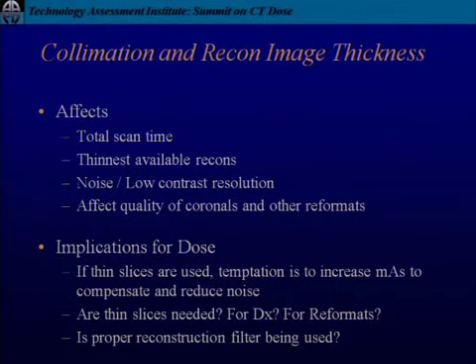There are some scanners out there that, should I go back in history a little bit? No, I won't name names. There were some that had a big difference. If you went from 4 by 5 down to 4 by 1.25, that was on the order of 30 to 50% difference between those two. Just if you change nothing but the beam width, the collimation. So these days it's not as big, but there are some that are still out there that can be a big difference.